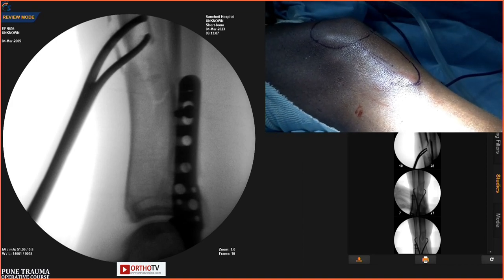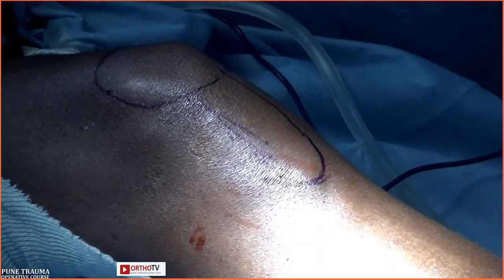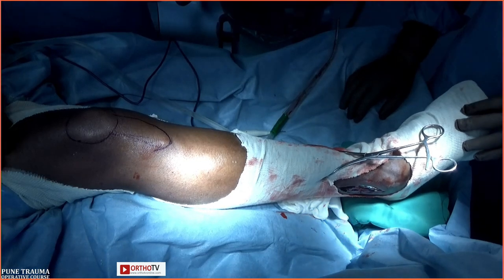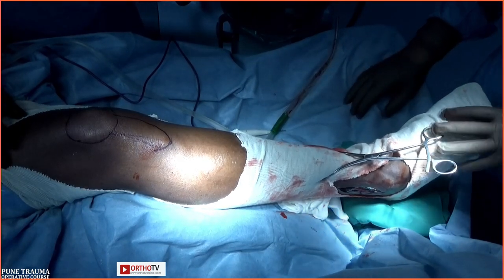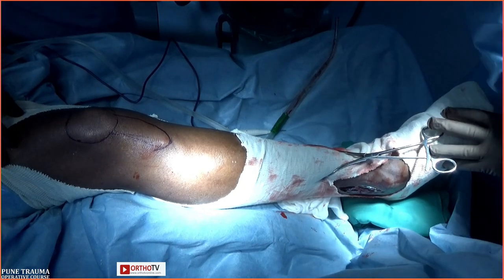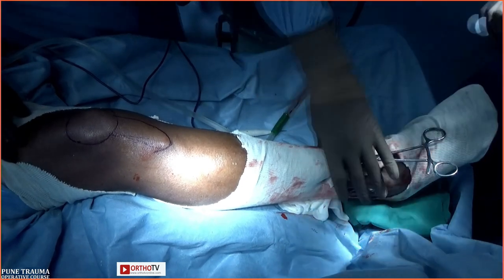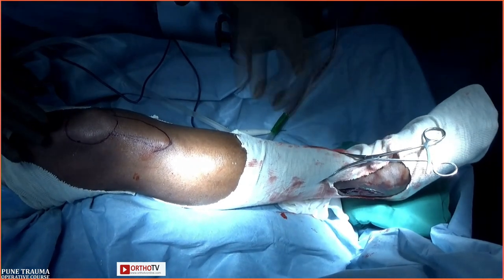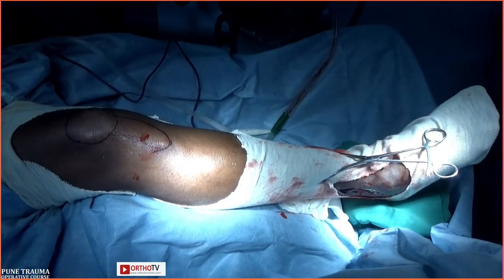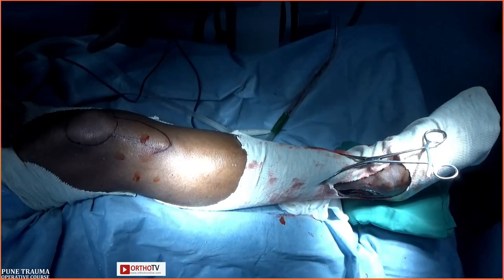Fibula cannot be nailed. So just for the benefit of the philosophy of management here, what we are trying to emphasize is that please do not confuse reduction and fixation with each other. A lot of times we would do both reductions simultaneously or one after the other and then stage the fixation. So if you have a transverse fracture of the tibia with the same fracture of the fibula, you would still want the fibula to be perfectly reduced. Okay, let's move on with the surgery.